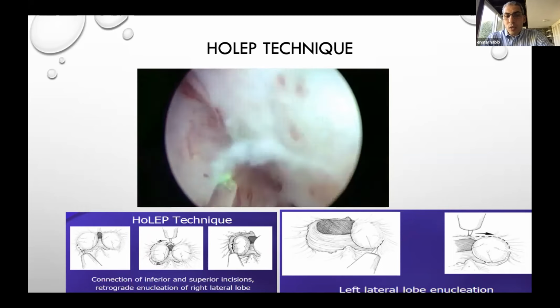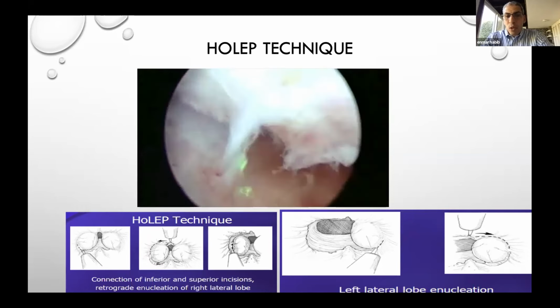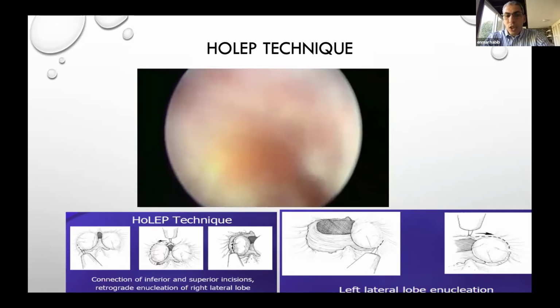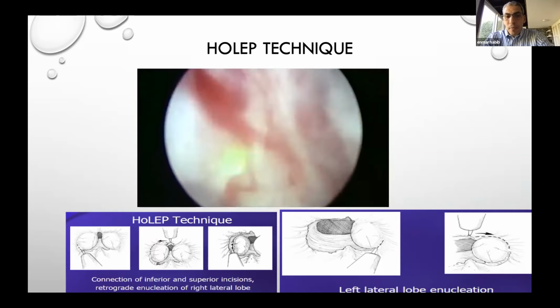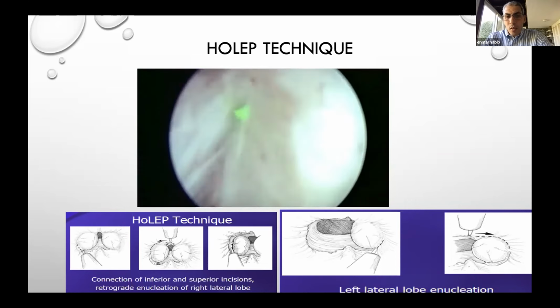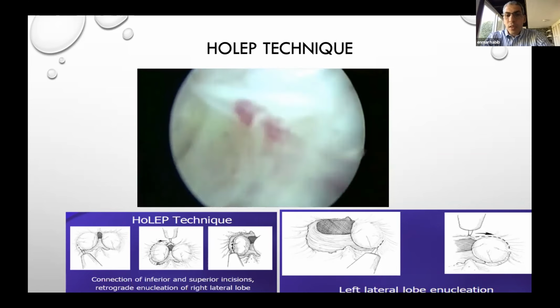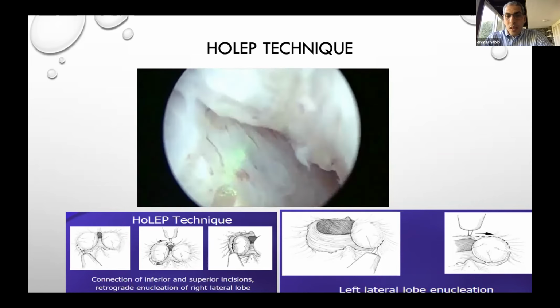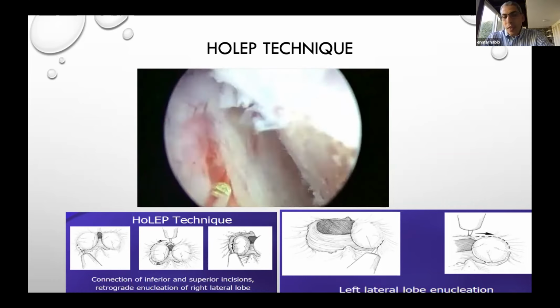At all times, we have to keep the adenoma under tension. So we are pushing the adenoma with the tip of the resectoscope, and the fiber is pointing at the site of attachment. We can see that I am not touching the tissues. So I'm leaving a space for the steam bubble formed at the tip of the fiber to help me separate the adenoma. It's like you have an assistant that does traction and counter traction. So you are seeing where it will be separated, and you see that most of the procedure here is done bluntly.